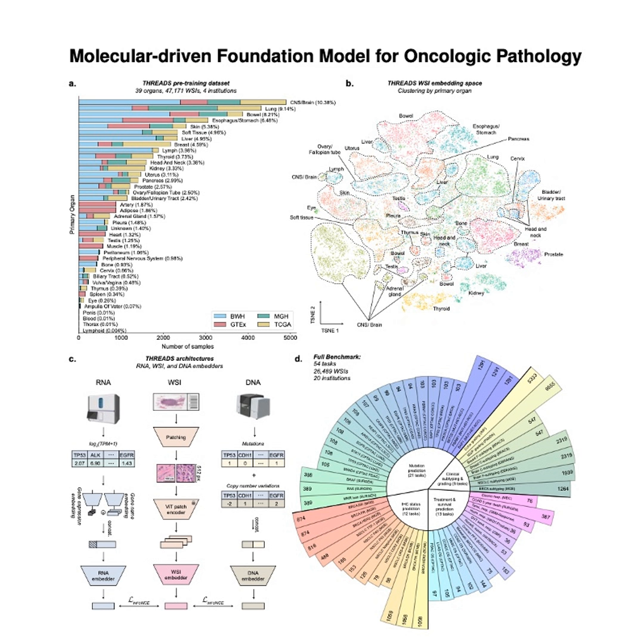It was. They grouped them into 4 main families, sort of going from more established tasks to the really tough cutting-edge ones. Oh, boy. So first, you have things like clinical subtyping and grading. 8 tasks there. Think standard stuff like Gleason grading in prostate cancer or classifying lung cancer subtypes. Okay, standard diagnostic tasks. Then, gene mutation prediction. 21 tasks. Predicting from the image whether specific driver genes like KRAS or EGFR or IDH1 are mutated. Which is huge for targeted therapy.